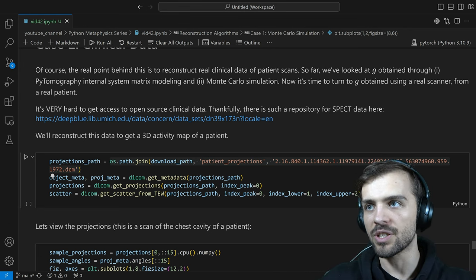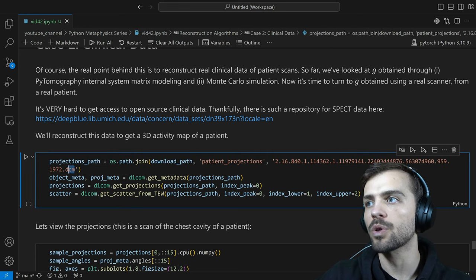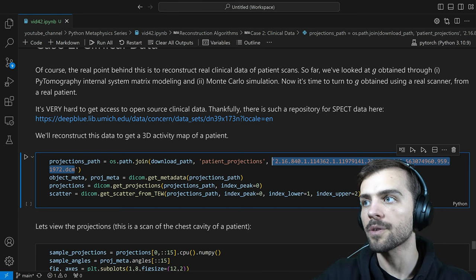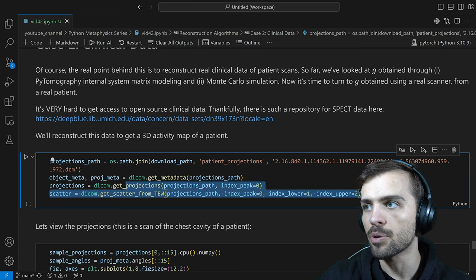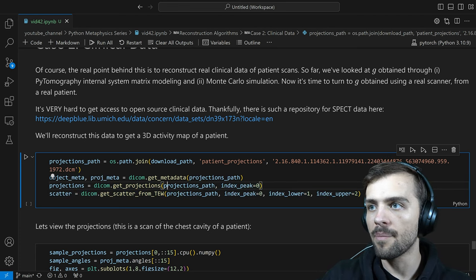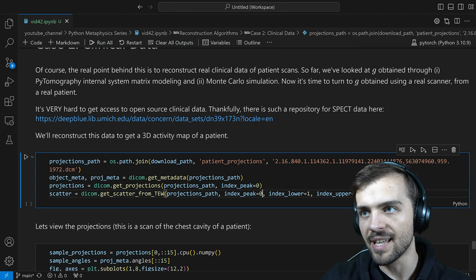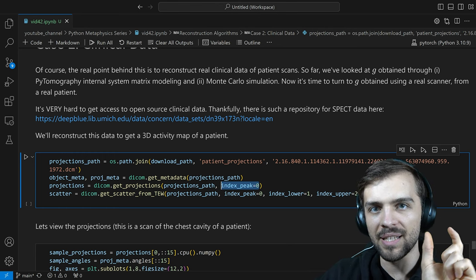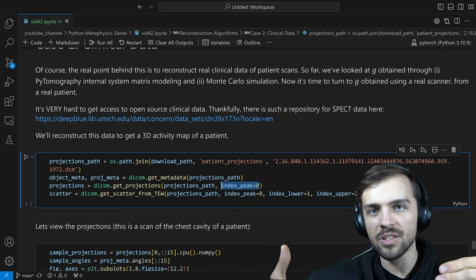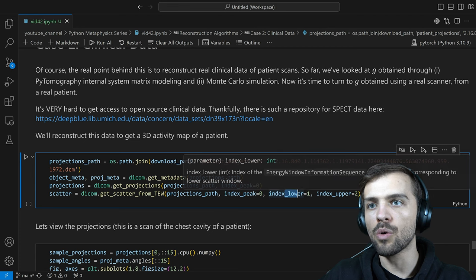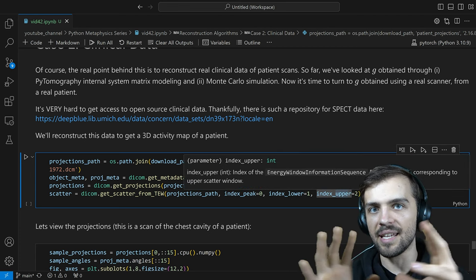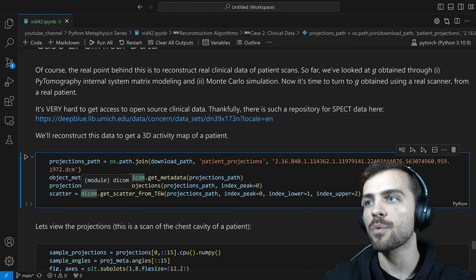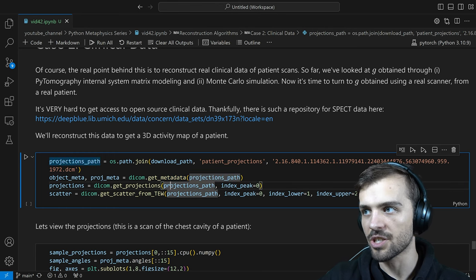This is similar to what we did with SimSET, just for DICOM data now. I give the projections path — this is an actual clinical DICOM file containing the image G. We extract metadata and get both the projections and scattered data from that file, estimating scatter from the triple energy window. There's an index_peak corresponding to the photopeak — the detector configured to look for, say, 208 keV photons. The lower and upper indices correspond to slightly lower and higher energies for scatter estimation. We can get our projections and scatter using the DICOM functionality.